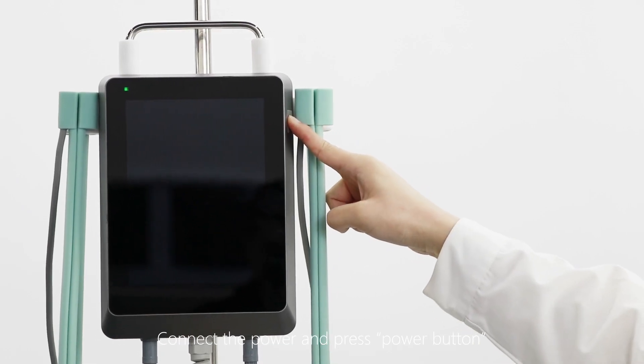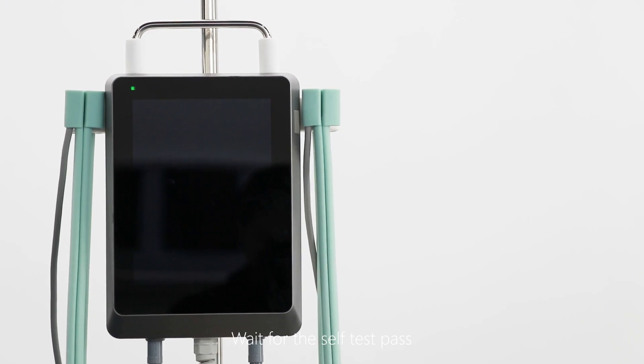Connect the power and press the power button. Wait for the self-test to complete.